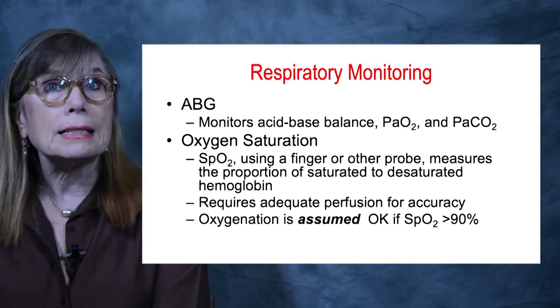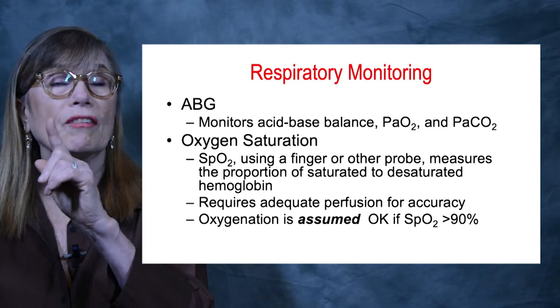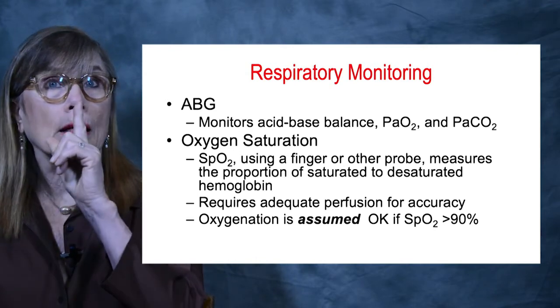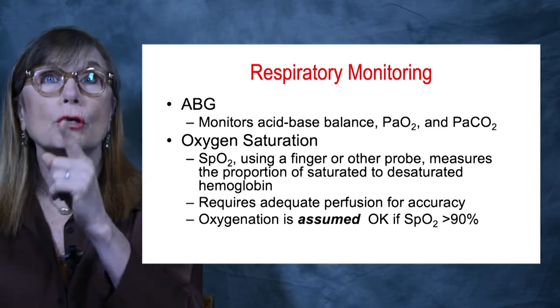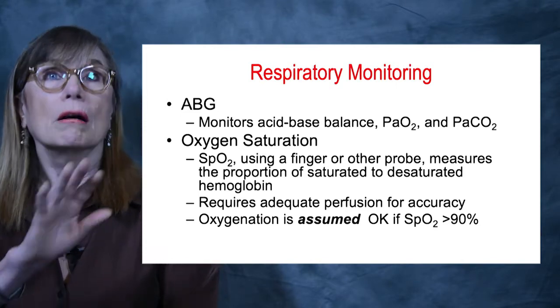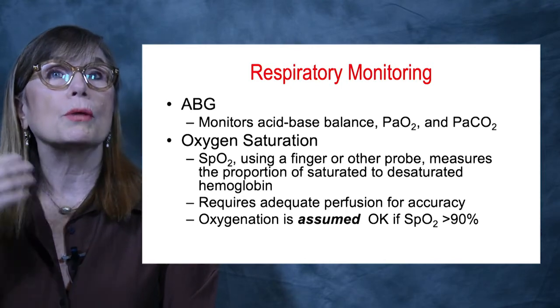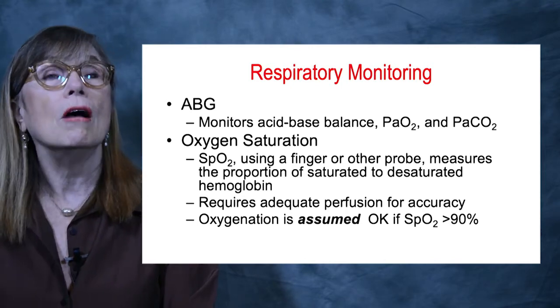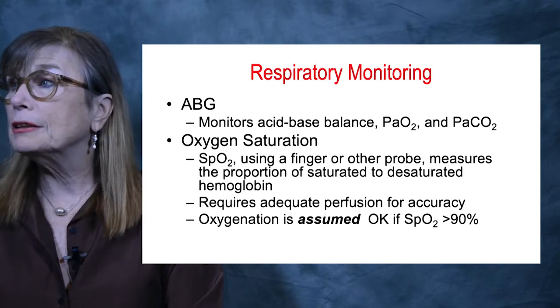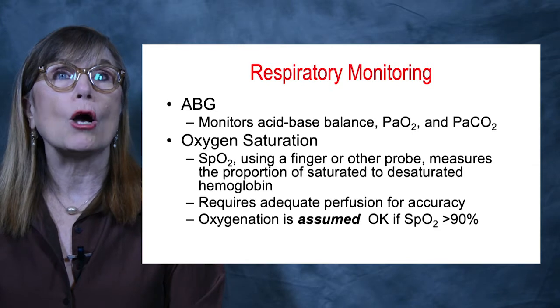But it is important to remember that when you put the pulse ox on the index finger and you can't get a reading, the most important issue is, do you have a pulsatile picture? If not, you should forget doing the other finger and move up to the ear or to the forehead for evaluation. You must have pulsatile blood flow in order to read SpO2.